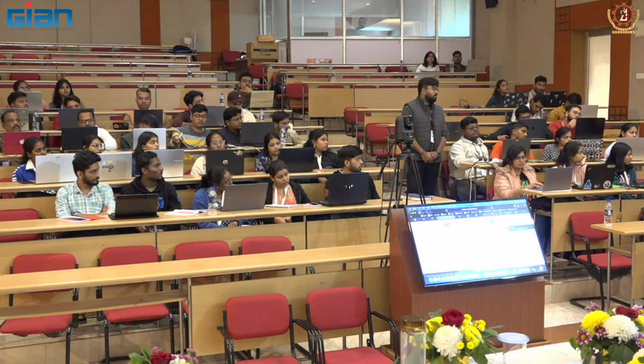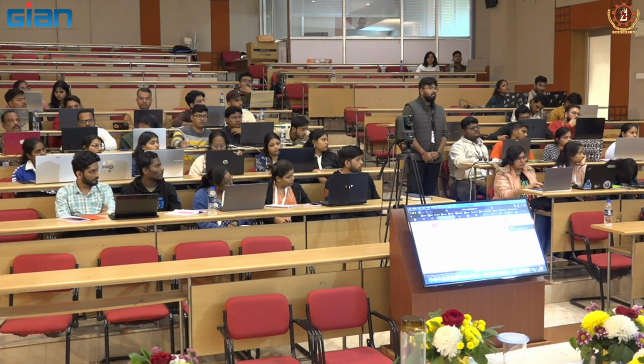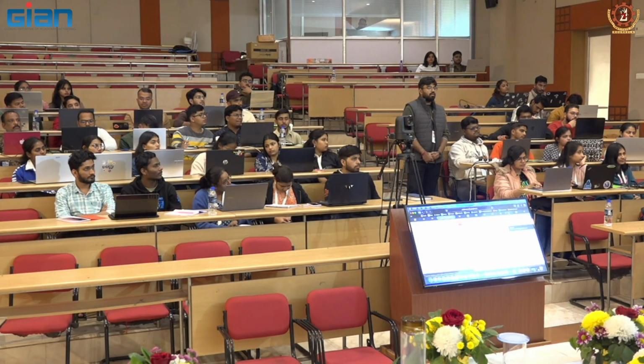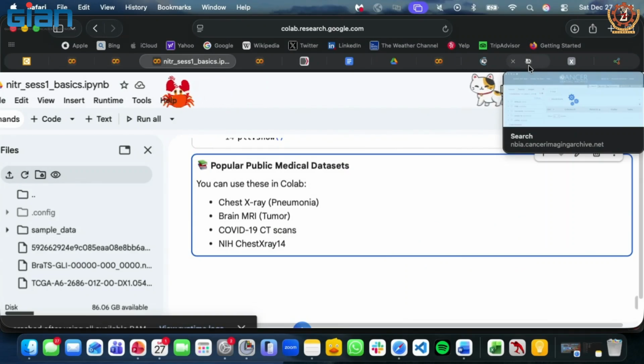But there are some images which are like 2 GB, 3 GB, and there are thousands of images. Oh, so you don't want to download them to your local computer. You should ideally download them to your server, which has TBs of space. The good part is, if you know these are the 10 different patients you want to download, you can just add those 10 patients, and yes, they will again be 30 to 40 GBs in total. SVS files are large, so you can't help it.